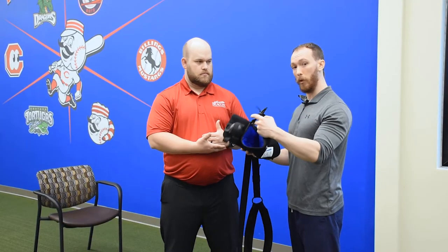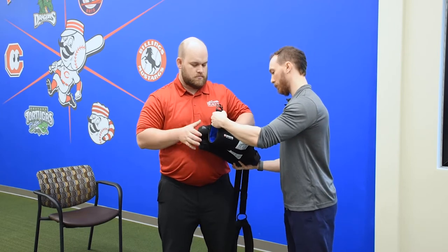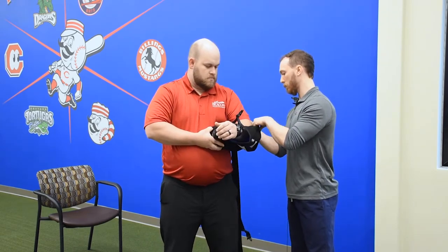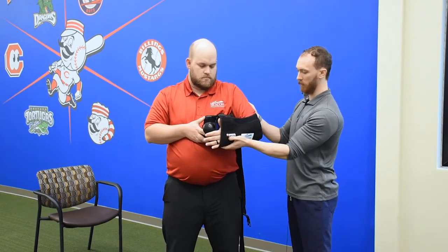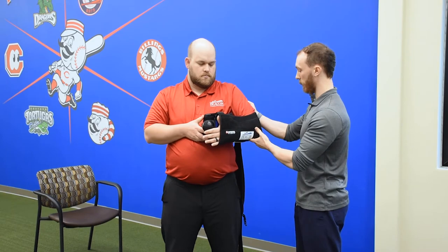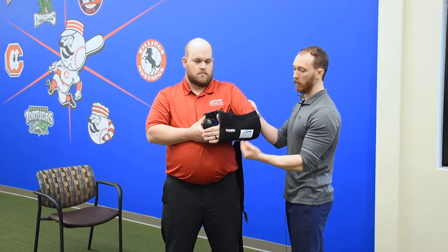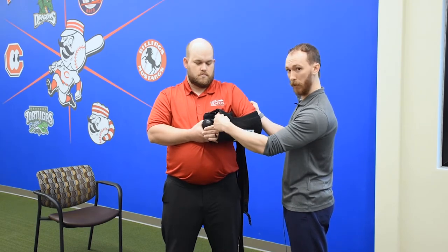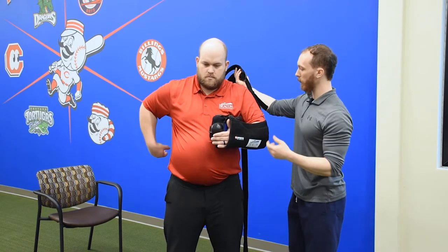Now we're going to put on the post-op sling. We'll start by sliding the arm into the canvas here. We want to make sure that the forearm sits flush into the bottom of the canvas of the sling and that we get our elbow towards the back of the canvas. We want the knuckles right at the edge of the canvas here.